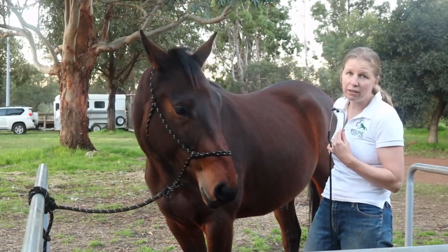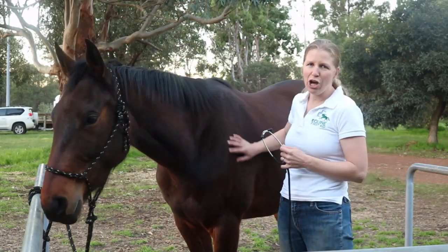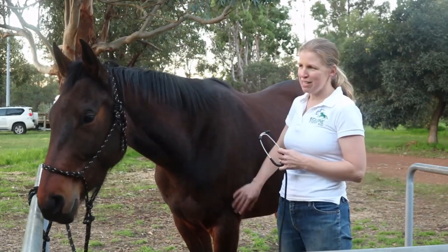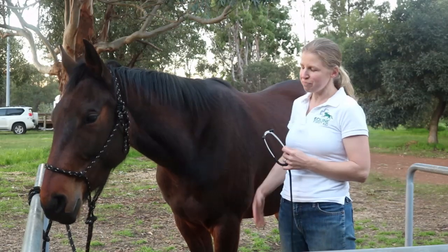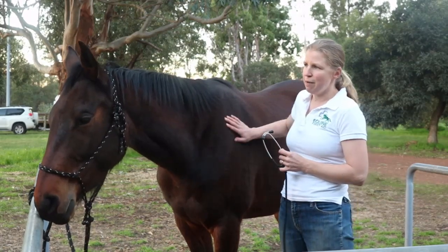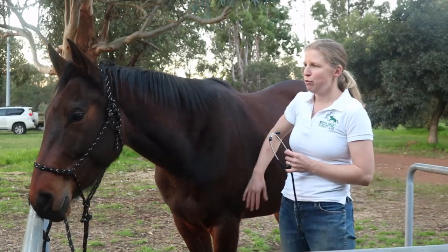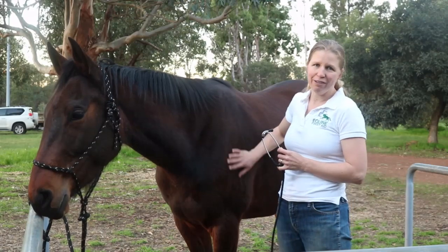That means his heart rate is 40. It's a little bit elevated, and that's probably because I've just brought him over here and tied him up — there have been a few things going on around him. I'd probably just come back in another 10 minutes and take it again to try and get an average heart rate for him.